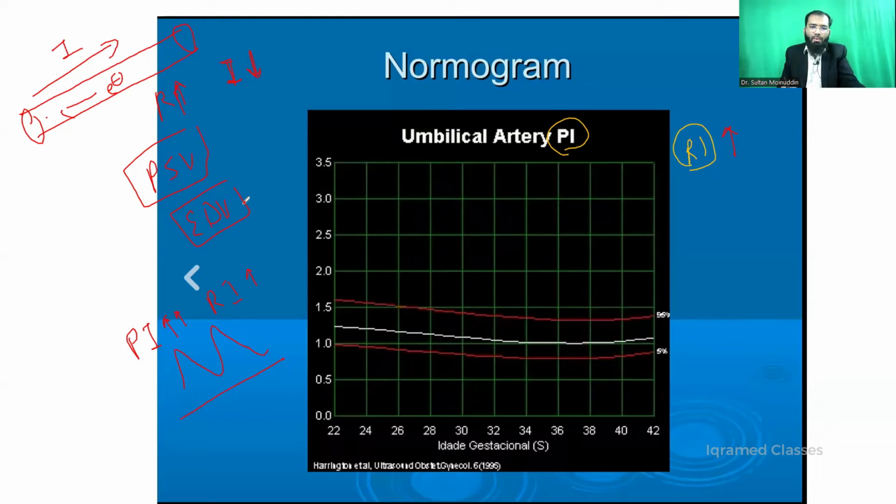So now we have put color Doppler here and we have obtained the trace. This trace is velocity against time. See now, this is how we measure the PSV. Are you able to see how PSV is measured? I have put my pointer just above the waveform and you are able to see that the PSV readings are obtained. Okay. Now see here, this is the Mickey Mouse.